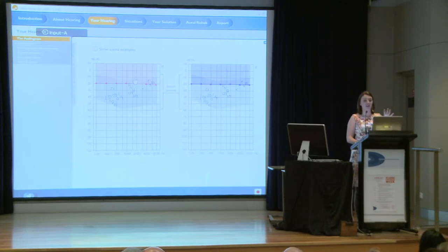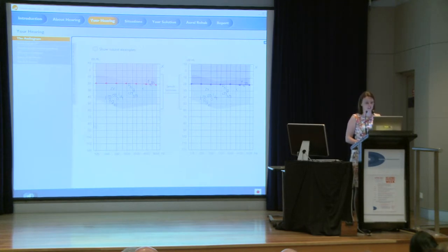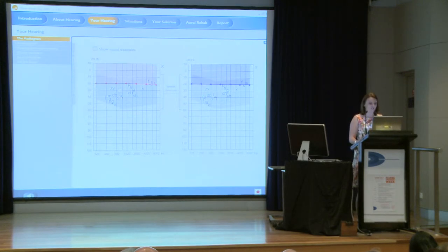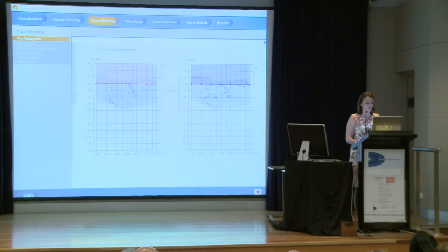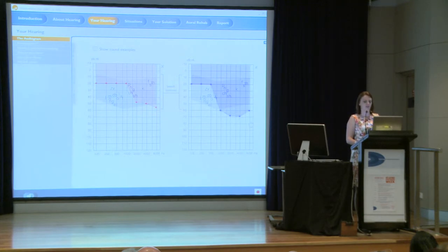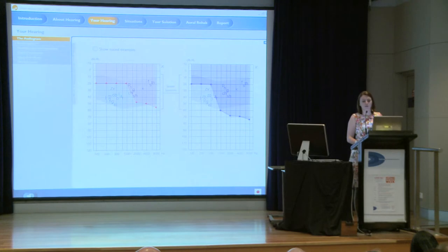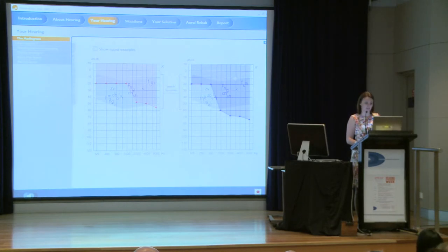On this screen are audiograms for the left ear and the right ear. The left ear is always blue in audiology and the right ear is always red — red for right, they both start with R. Age-related hearing loss is called presbycusis and normally affects the high tones, so we might see an audiogram something like this. In some situations it can drop down a bit further, like the left ear, and often it gradually progresses over time, so the left ear is a little bit more severe than the right. On the audiogram you can see the sounds that would be missing — a lot of the consonant sounds like 'sh', 'f', and 's' — especially in the left ear.